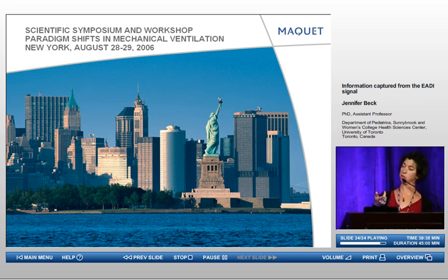And again, as Christer mentioned this morning, the impact of a slowing of the conduction velocity of this signal is actually an increase in the power of the signal. So because it gets slower, in essence, it gets a little bit bigger. So yes, the waveform would get larger just from that phenomenon. On the other hand, if you start to have contractile fatigue and your muscle becomes weaker, to maintain the same ventilation, you would have to increase your respiratory drive.